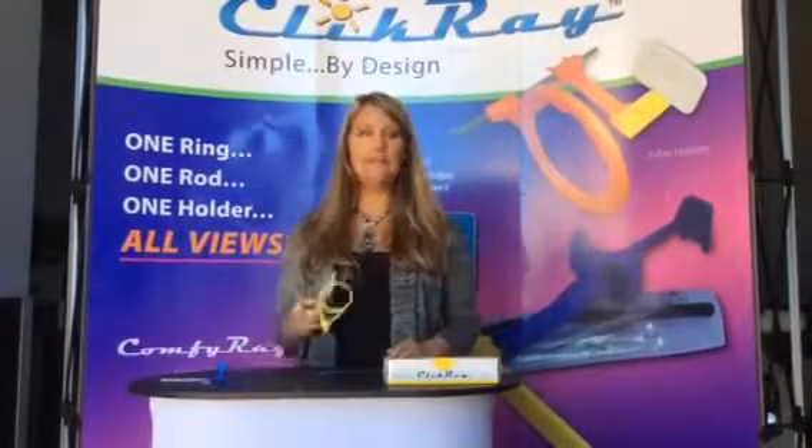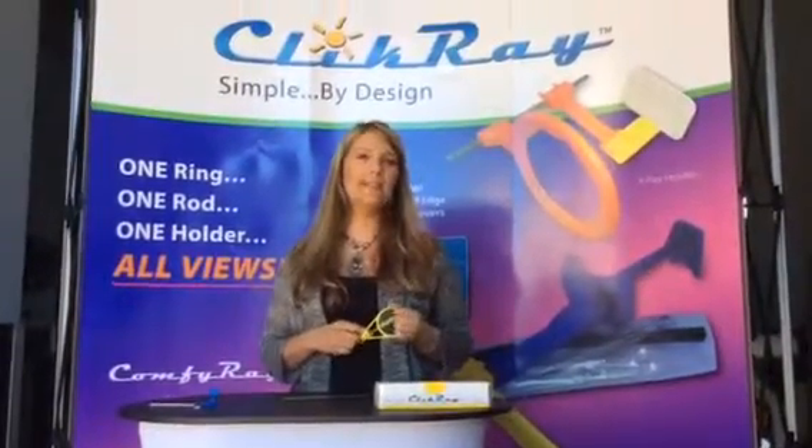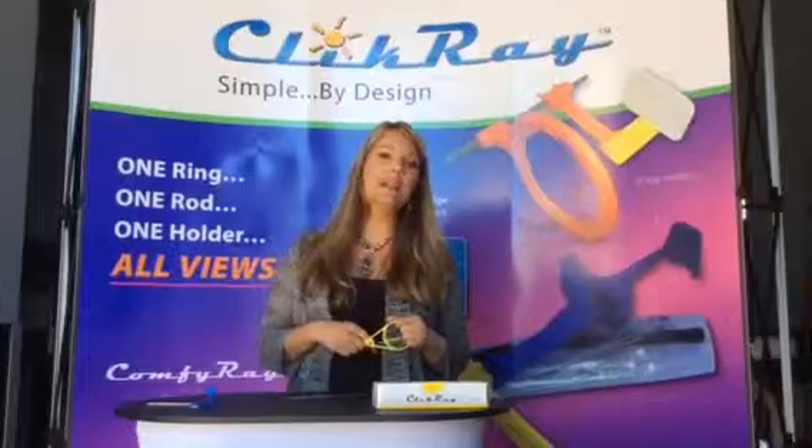So this is our system — nice, simple, easy to use. If you have additional questions please visit us at www.clickray.com.